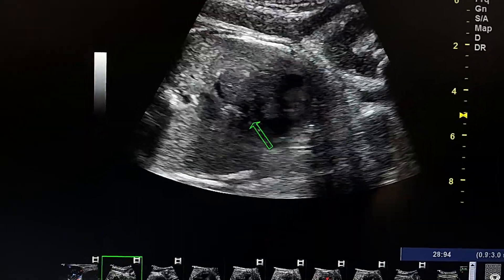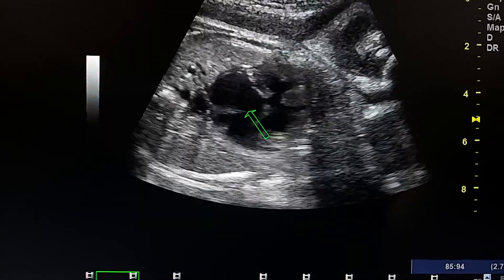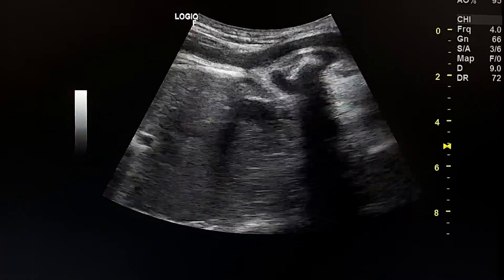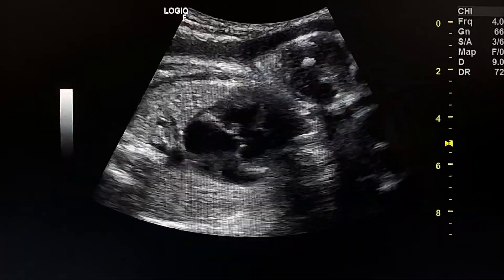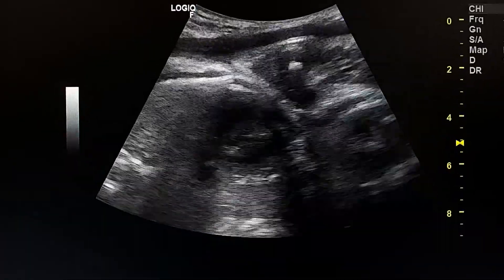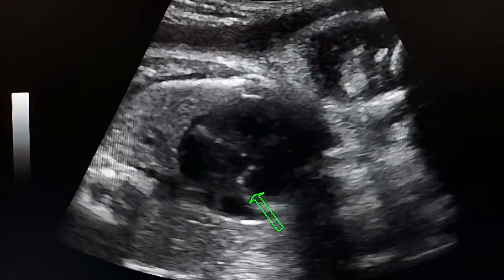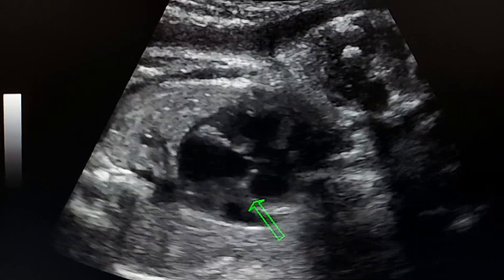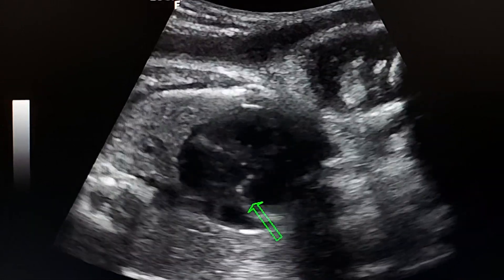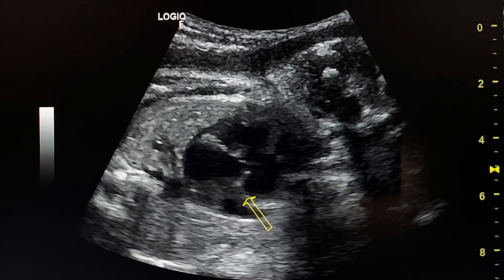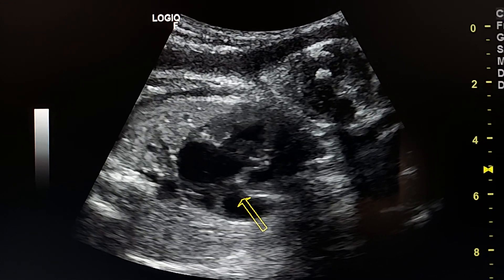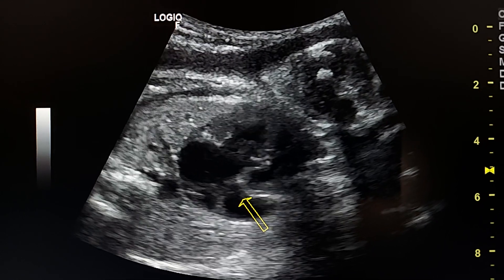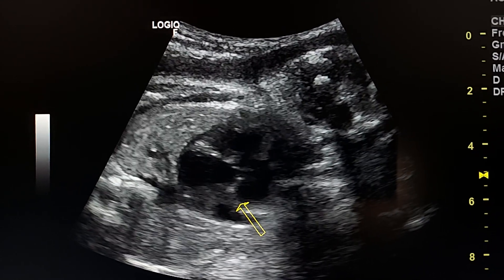Between the two atria we see a large ASD. Here we see the fibrous band at the site of the tricuspid valve. It separates the right atrium from the right ventricle.